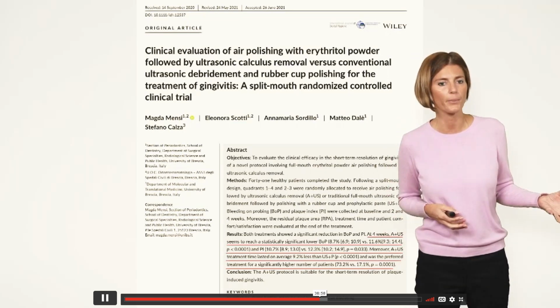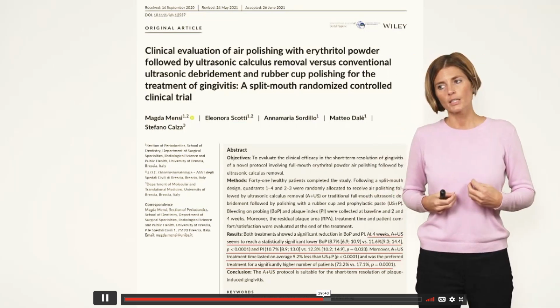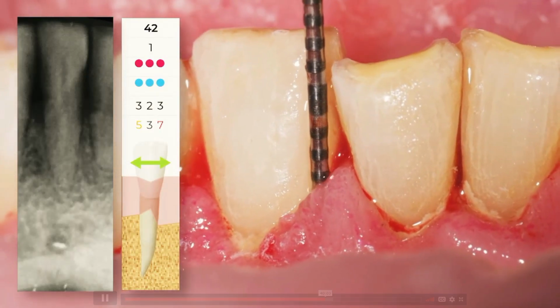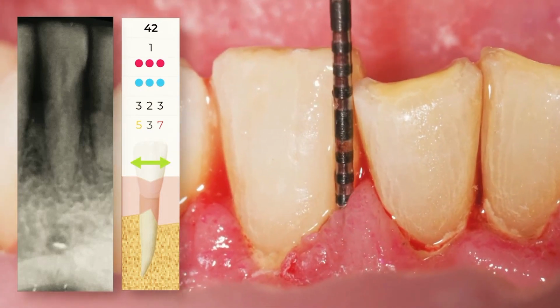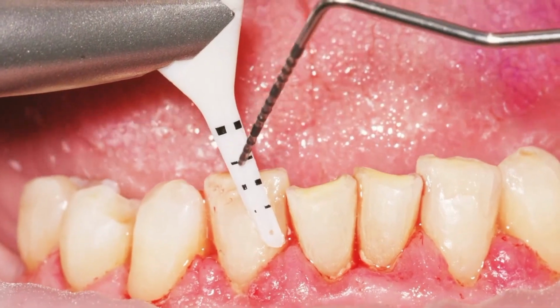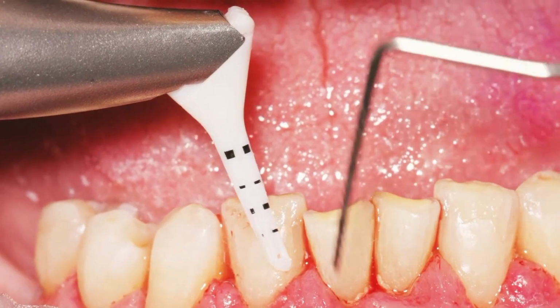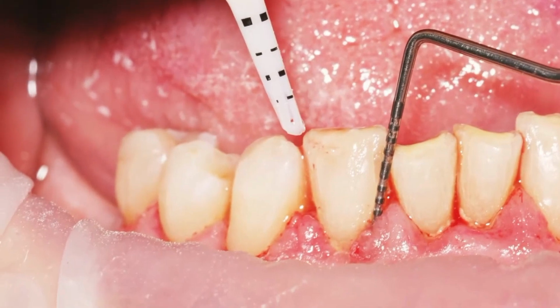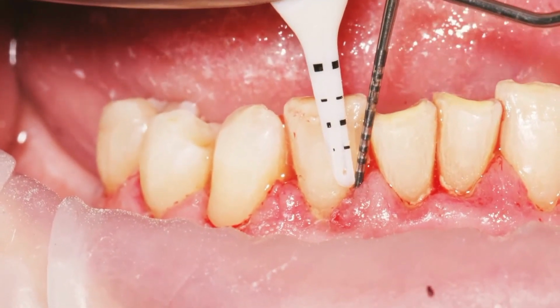In terms of the approach, that is the sixth step, the periflow nozzle in the periodontitis patients in this kind of sites, as you can see, 7 millimeters in this pocket, but also in the periimplantitis patients and in the mucositis. And in this case, we have mucositis and periodontitis. So you can see in the video how we use the periflow nozzles.